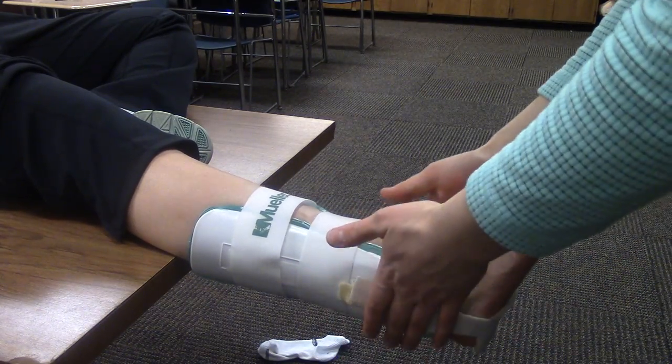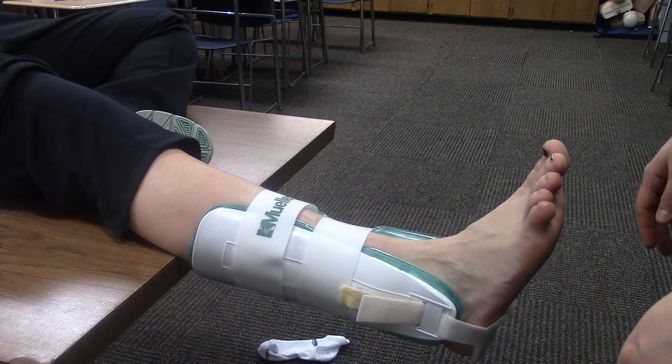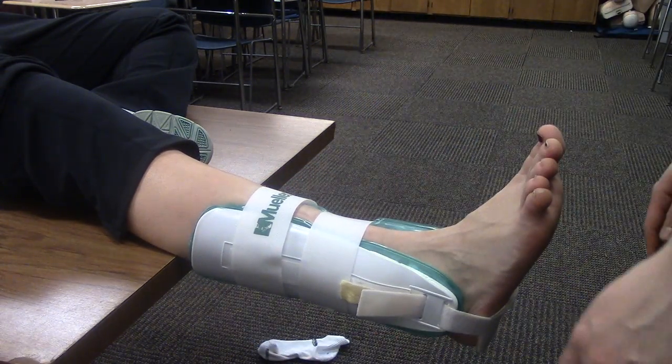She can wear this to practice under her shoes and even to a game if she needs to, just for extra support on her ankle. And that's the AirCast.